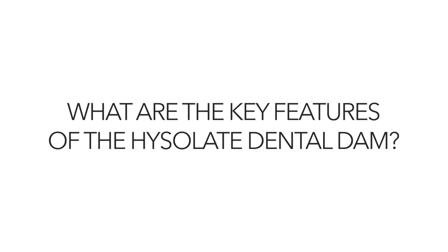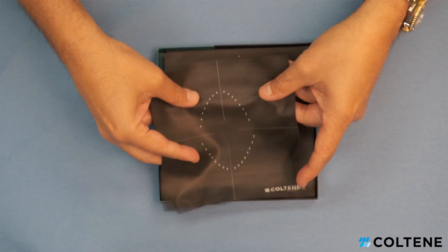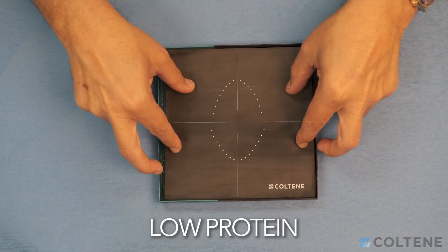The key features of the Hyslate dental dam — I think the two most important ones are non-powdered and low protein. The reason why this is important is because we are all afraid of using latex in our offices, thinking it's going to create hypersensitivity reactions in our patients. Taking away the powder and having low protein is going to substantially reduce that risk.